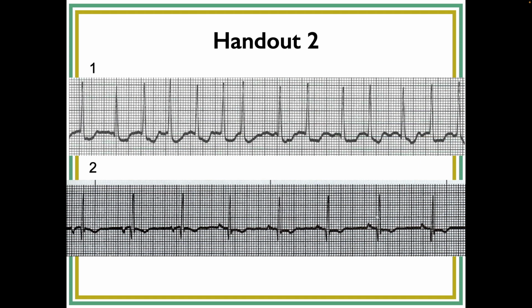Some of them actually bounce around right in front of the QRS, but there's no P wave here. I wouldn't call anything here a P wave, okay? So what I would say here is no P waves. And so that takes you to PRI, and if there's no P waves, the PRI step is super simple, non-existent, okay? So then the question is QRS.